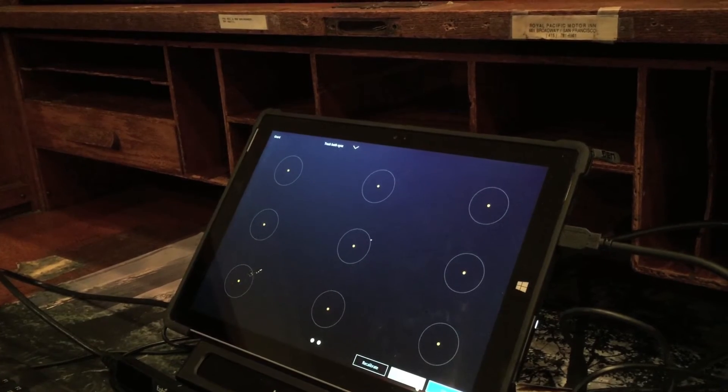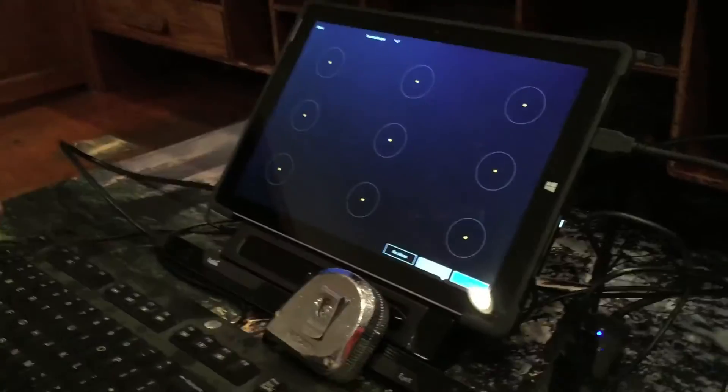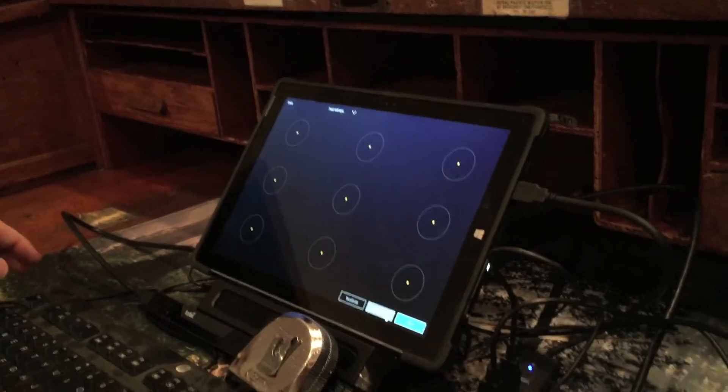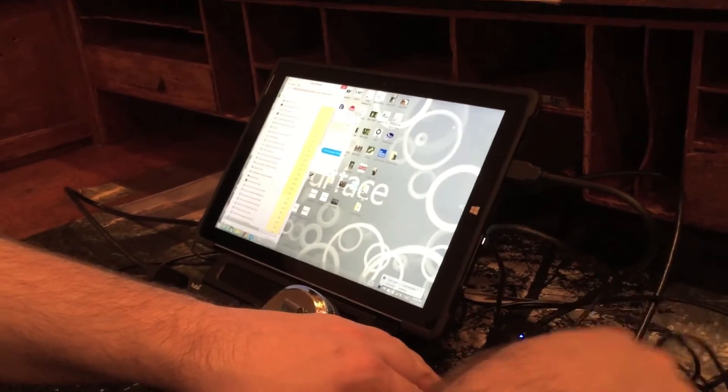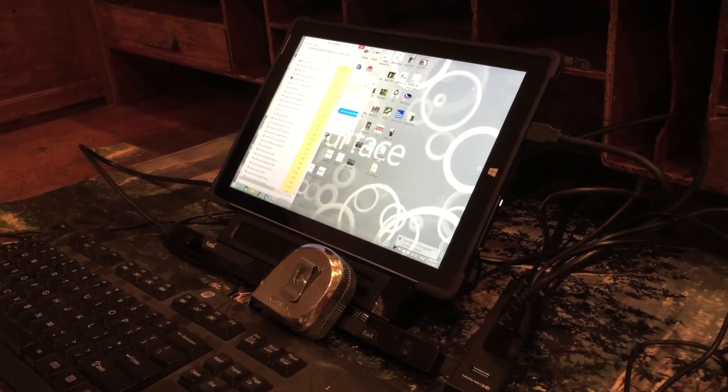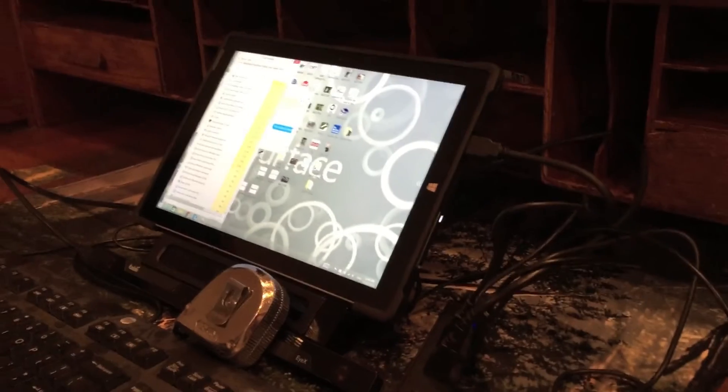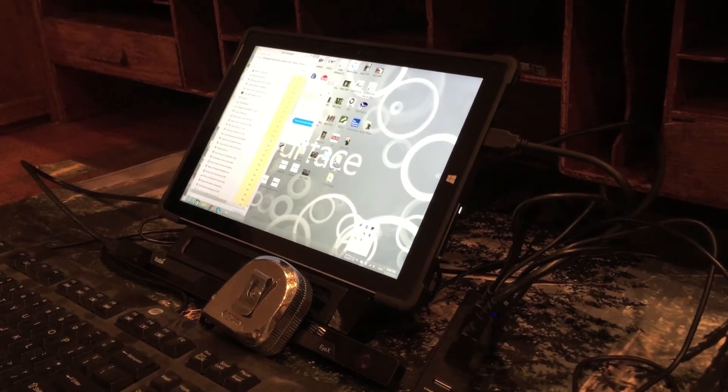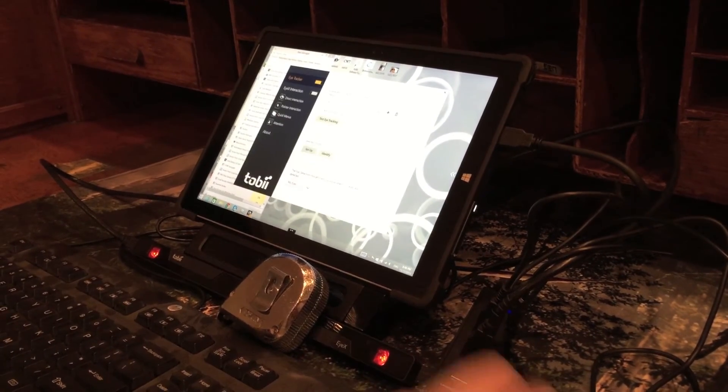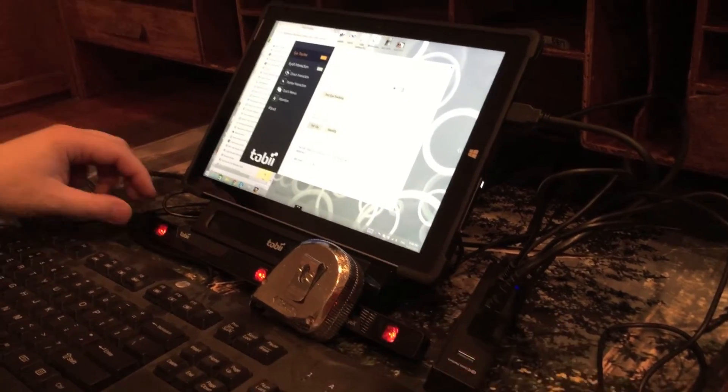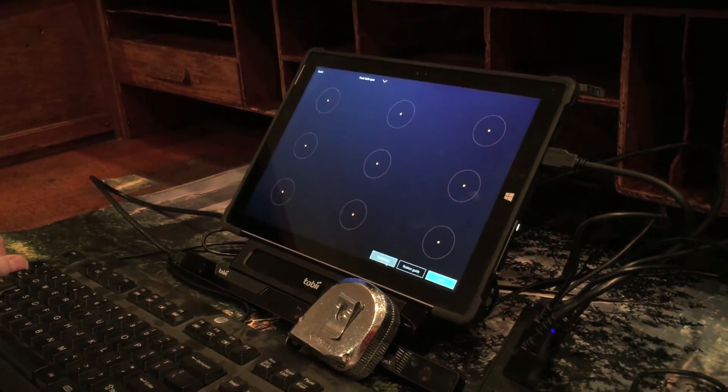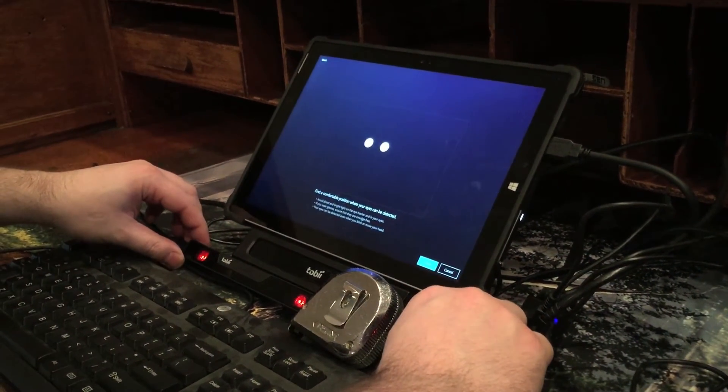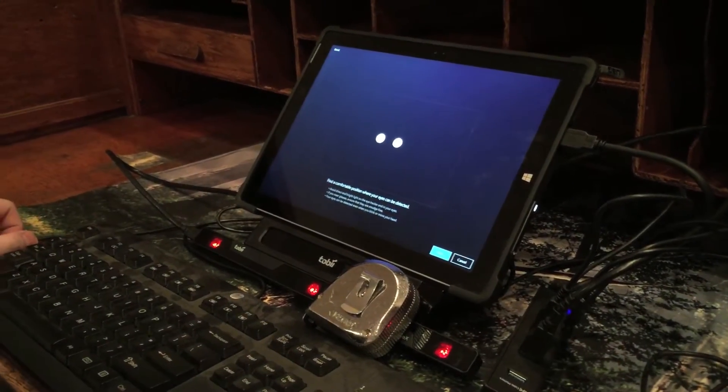So we will kind of MacGyver this tracker into position, unplug the PCI. I can't have my keyboard plugged into the USB hub because during the calibration process I guess the Tobii takes too much power and it will disconnect the iX. So, settings, we're not covering any of the LEDs, and even if we are it's going to be better anyway, so who cares. So we'll adjust this to put my eyes in the middle of the track box, right about there. We'll calibrate.